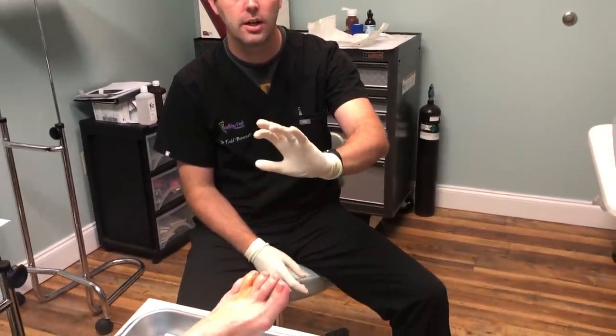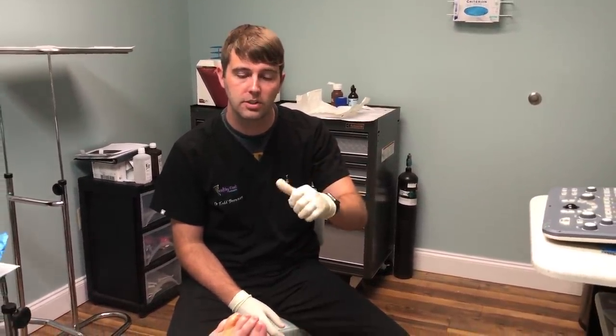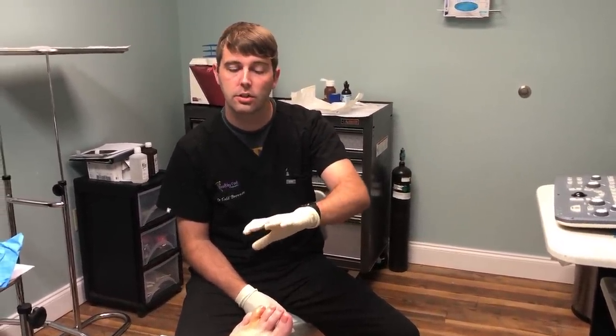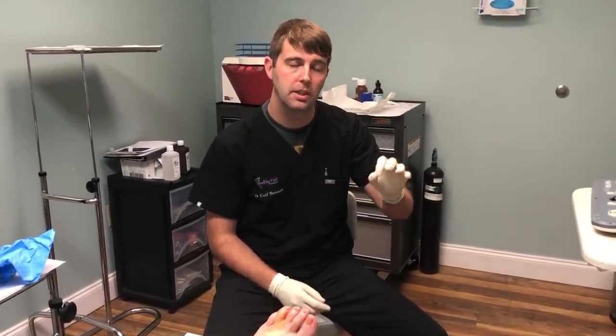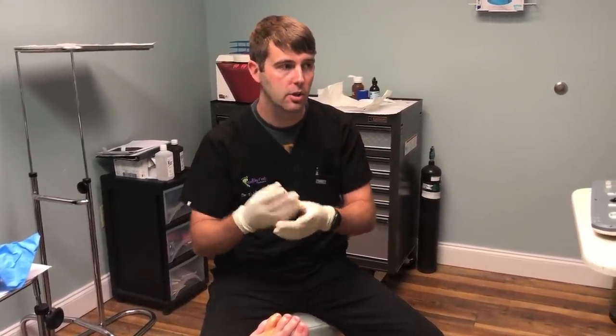Hey, Dr. Todd Brennan, Healthy B Podiatry. Today we have a cryoprocedure — we've talked about it in the past. Cryosurgery is for neuromas. It's a very specialized procedure to help treat neuromas minimally invasively, so not going into the OR, opening it up and taking the neuroma out. It's something very specialized that we offer here at our practice.